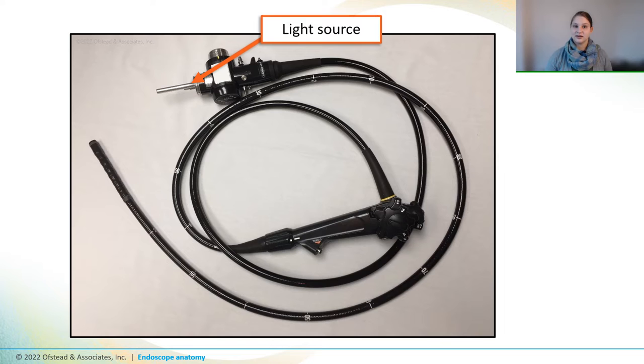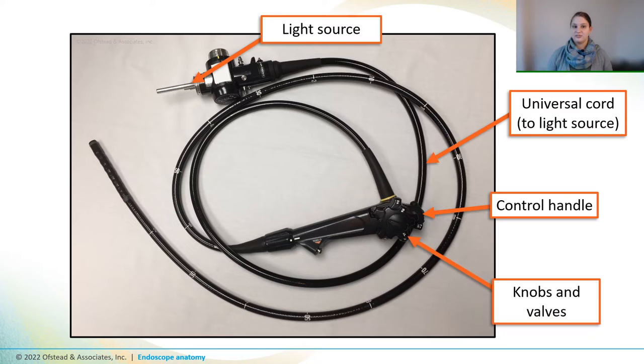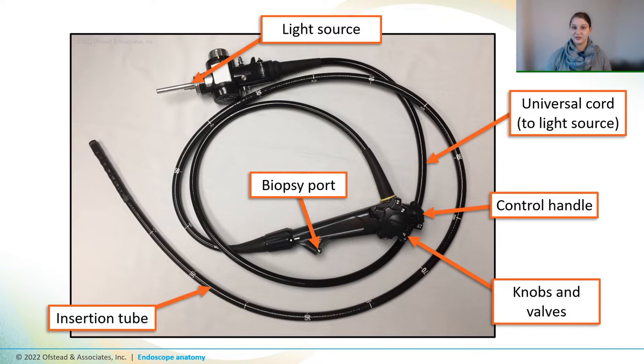The light source here plugs into the tower with the monitor and keyboard. It's connected to the scope by the universal cord. The control handle has knobs for controlling the bending section, and behind those knobs are valves for suction, air, and water. The biopsy port here allows the endoscopist to insert instruments through the insertion tube, which is the part of the scope that actually goes inside of the patient.